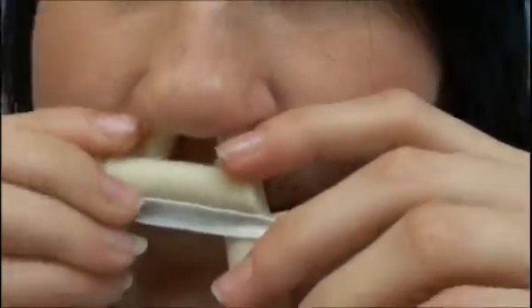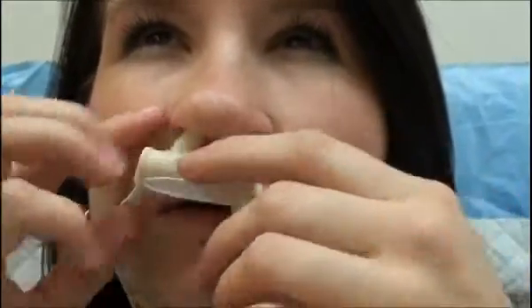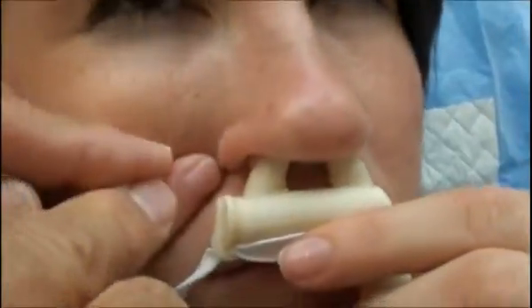Get it all the way up to the hub. Now rotate it down like we discussed. Now go ahead and lift it up into the nose. Retract down is better — yeah, that's what I would do.